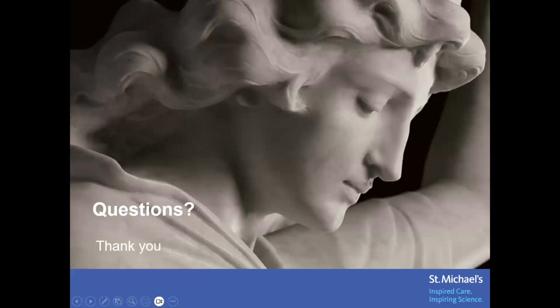If some of the staff who are here on the call have any thoughts on that, I'm happy to hear that. I wasn't able to come across anything like that. They just say still look at the maximum jet across the valve. But I'd be happy to hear any comments about that.